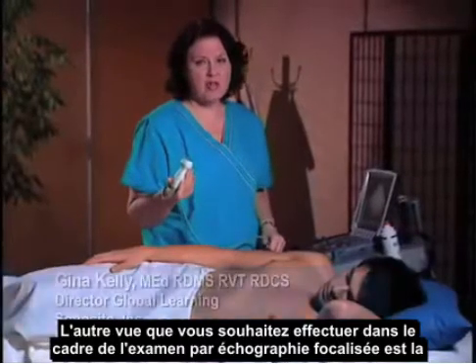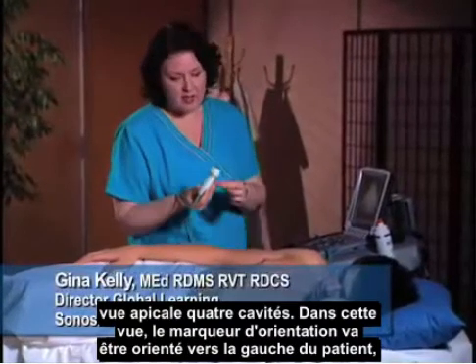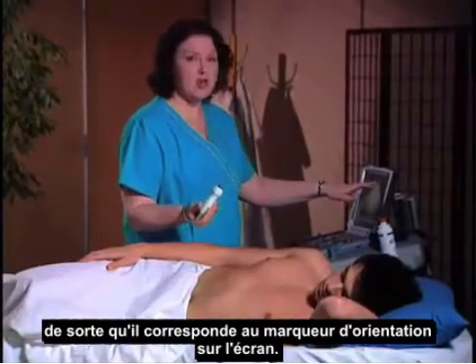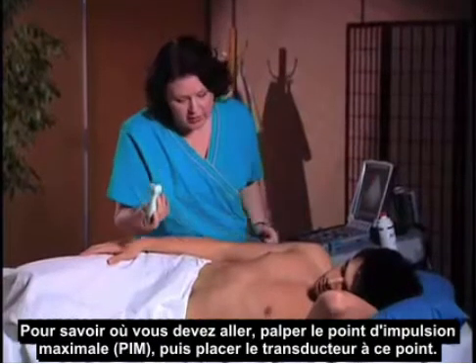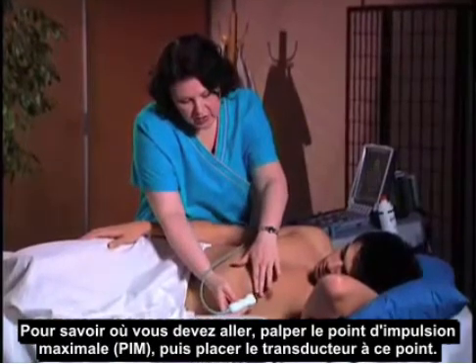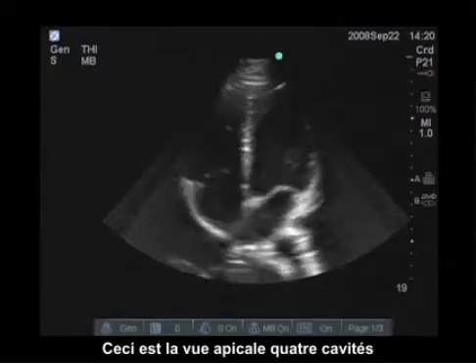The other view that you want to do as part of the focused echo examination is the apical four chamber view. The orientation marker for this view is going to be to the patient's left, so it actually matches the orientation marker on the screen. To identify where you need to go, palpate for the PMI and then place the transducer at this point. This is the apical four chamber view.